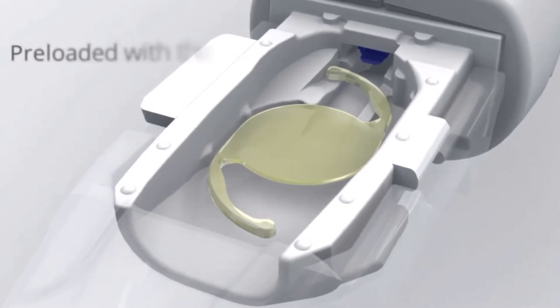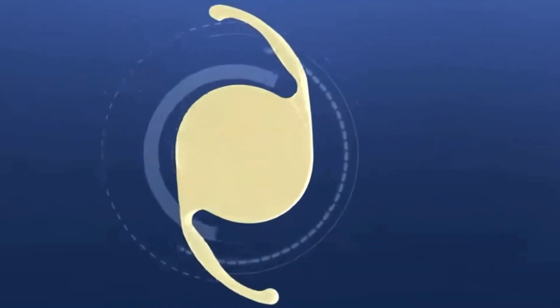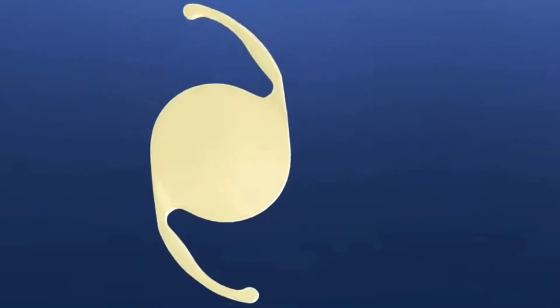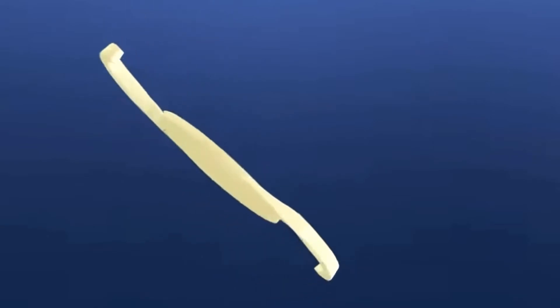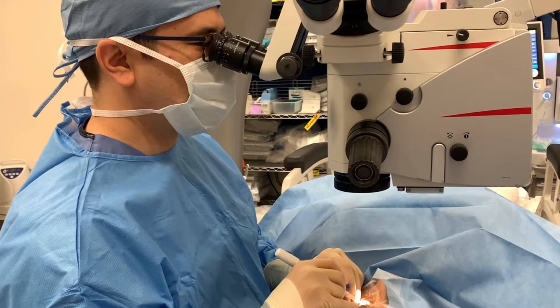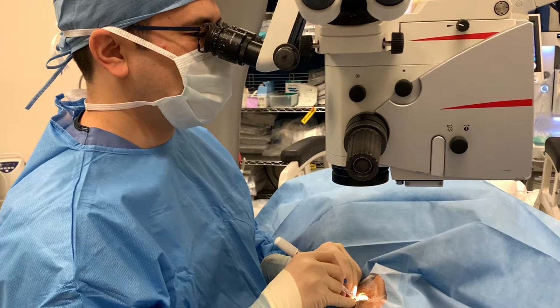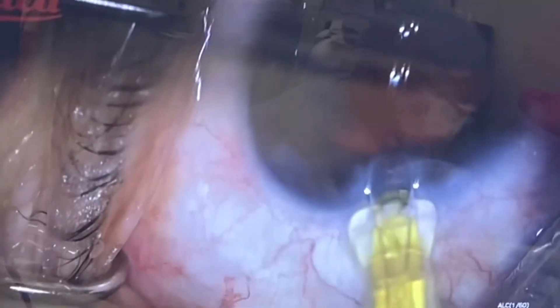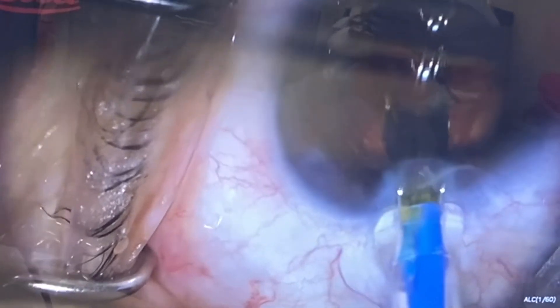It has the same A-constant we're all used to with the standard Acrosoft Aspheric lens we've been using for over a decade. But it's made with a new biomaterial with a specifically engineered edge design that reduces glare, glistenings, and dysphotopsias. By pressing down on that lever, it automatically takes it right into the eye, and then I just slide right to the capsule.